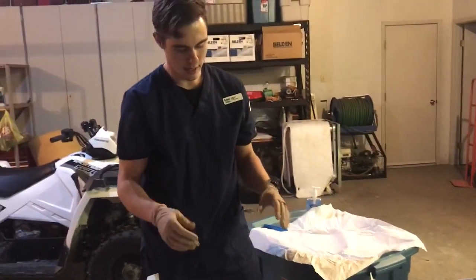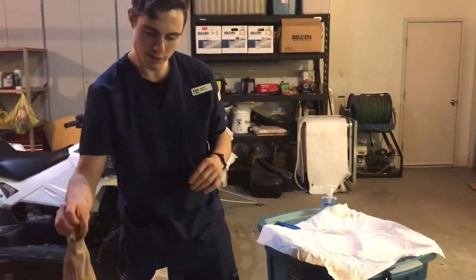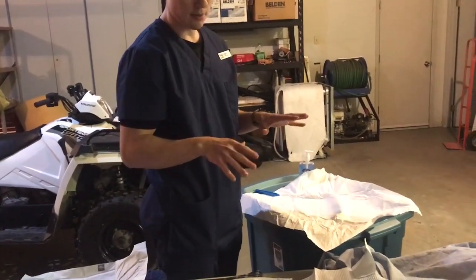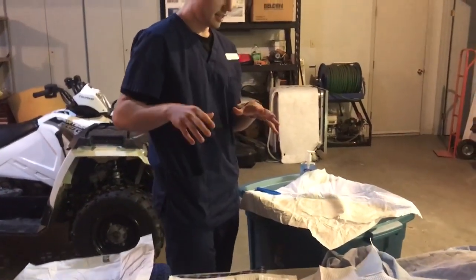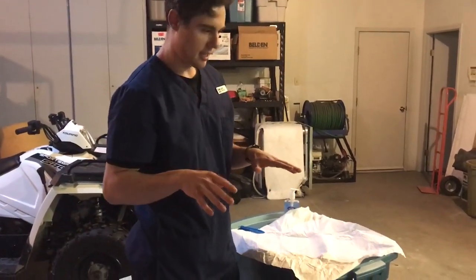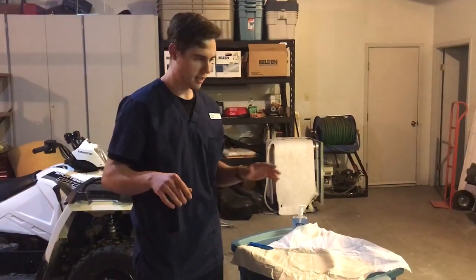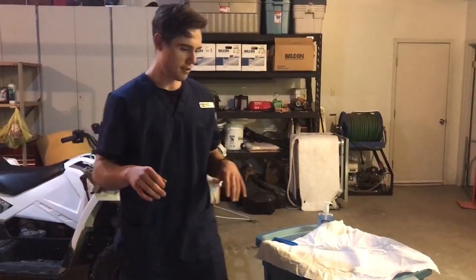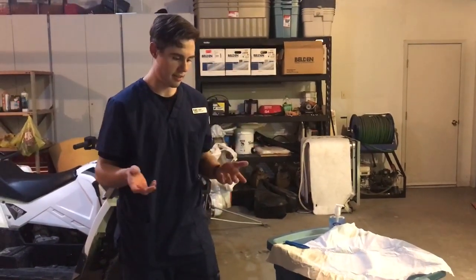I'm going to remove my gloves, throw those in the garbage. I'm going to make sure that the patient is in a comfortable position. I'm going to wash my hands after I take the gloves off. Make sure that the patient is comfortable, make sure that the bed is in the lowest position possible. Call bells within reach, they are comfortable and they don't need anything. After that, I will leave the room and do my exit safety check.